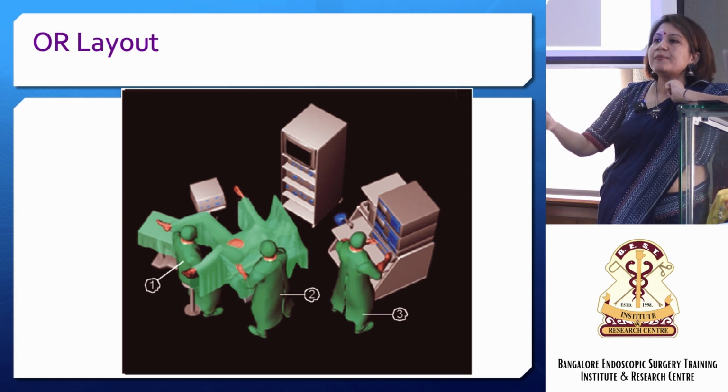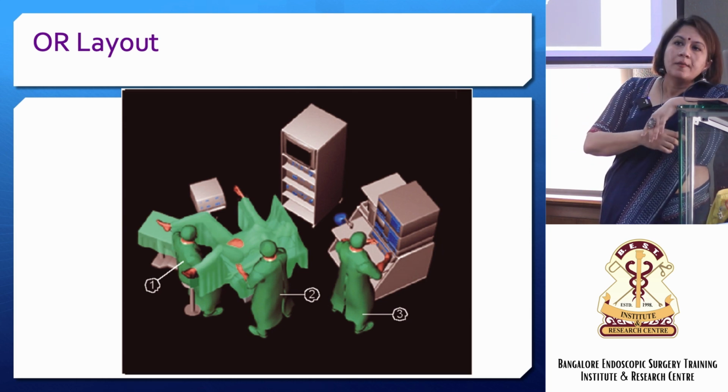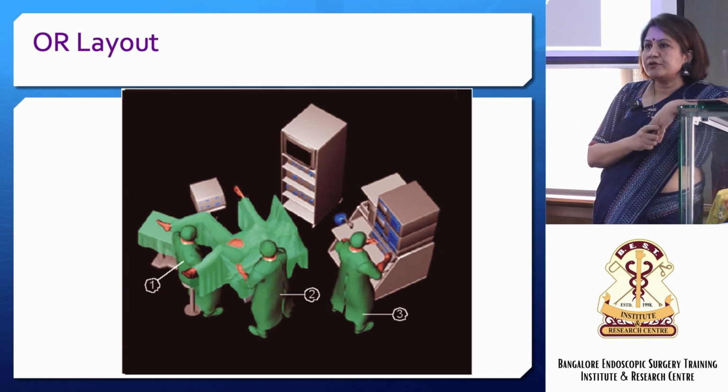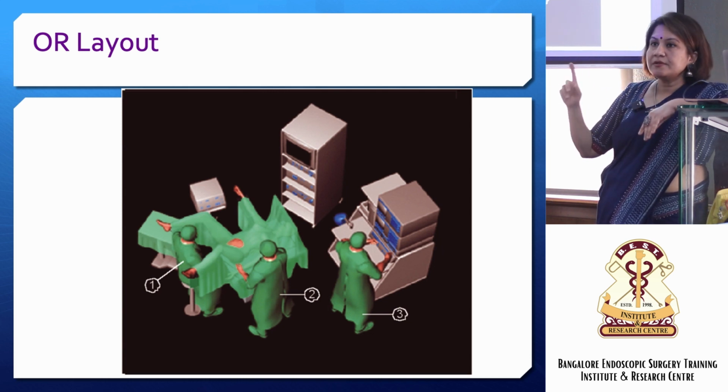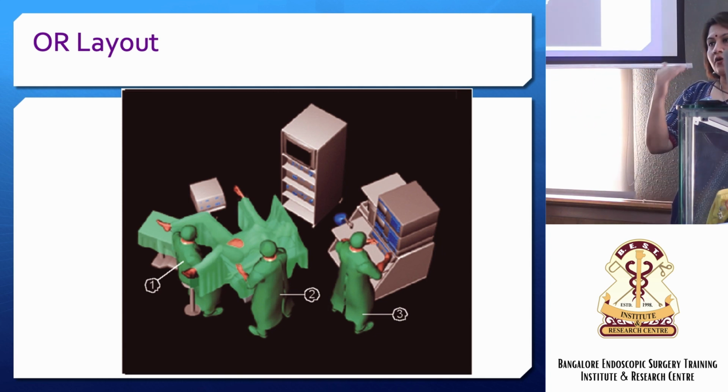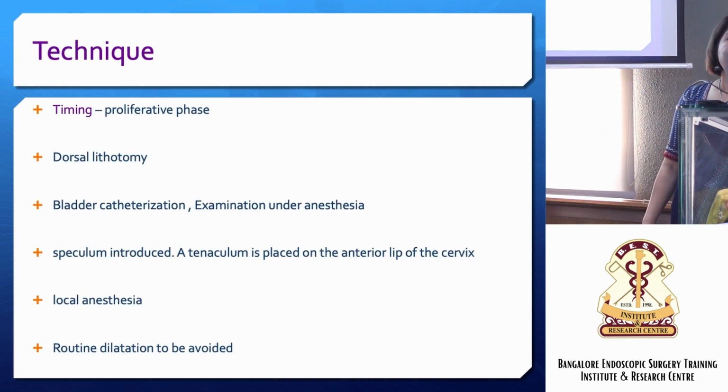So whenever you're doing a laparoscope and then coming back to a hysteroscope, make sure you tell the technician to move or at least turn the monitor towards you, because sometimes mirroring can happen. So this concept remains for any endoscopy procedure: the surgeon, the organ of interest, and the monitor in a straight line.